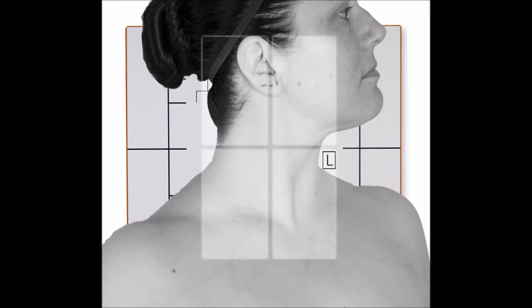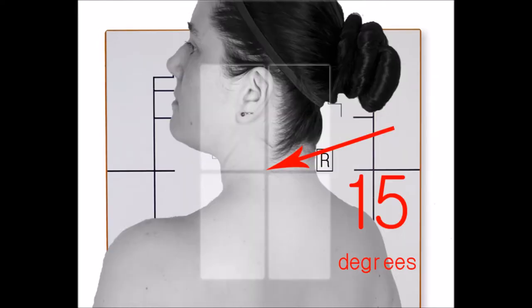A posterior oblique requires the CR to be angled cephalically at 15 degrees, whereas an anterior oblique requires a caudal angle of 15 degrees. Both are directed at C4. A grid is also optional because of the air gap between the patient and the IR.